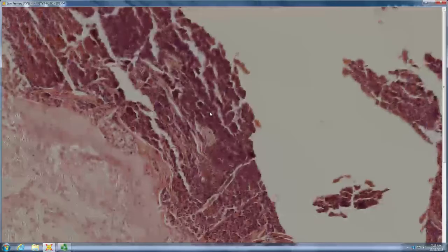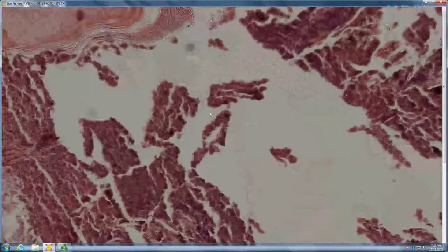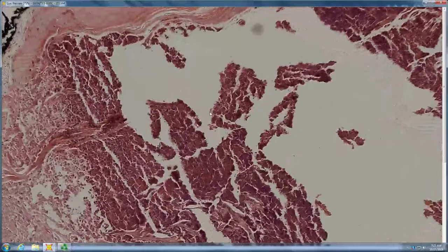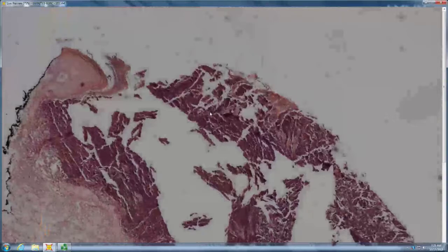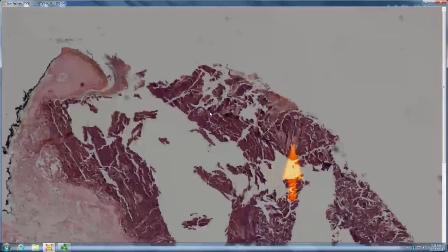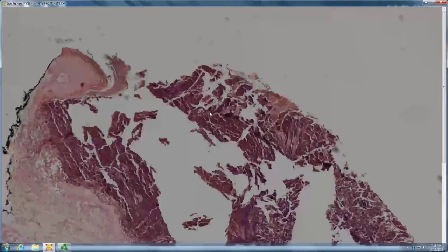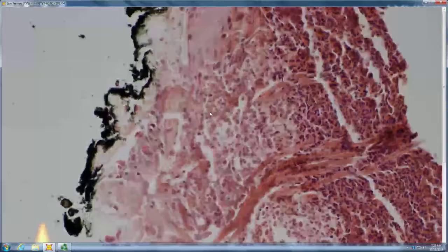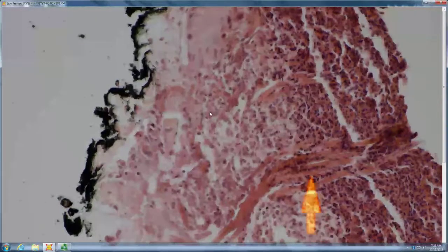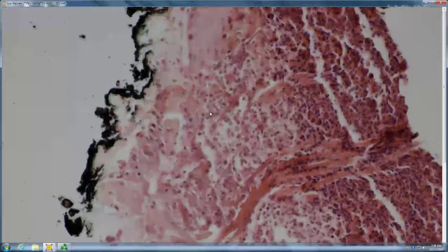Okay, how about this? Some areas of the epidermis, maybe there's some acanthosis here. There's acanthosis at the side. There's a big ulcer, inflammatory debris plug, and all this stuff up in it. And some of that stuff is vertically oriented, coming right out of the skin here. So what do you think that stuff is? Maybe some sort of perforating disorder. And is it elastic or collagen?